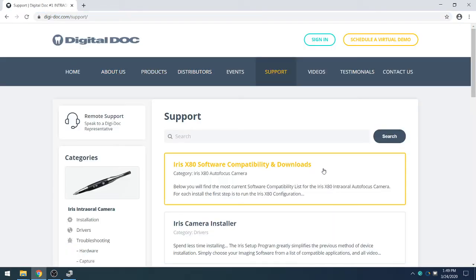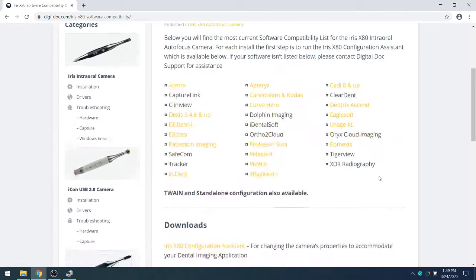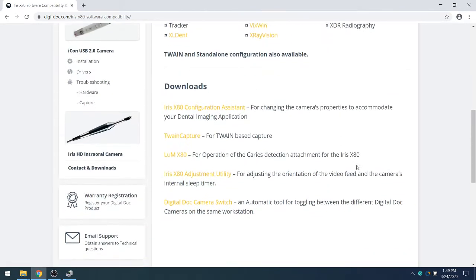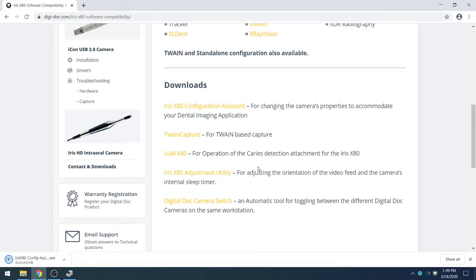From the support page, we will select Iris X80 Software Compatibility and Downloads. We'll scroll down this page until we reach the downloads and select the Iris X80 Configuration Assistant, and that will begin downloading.